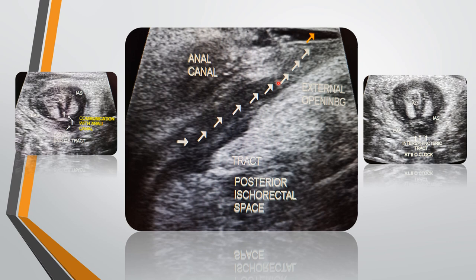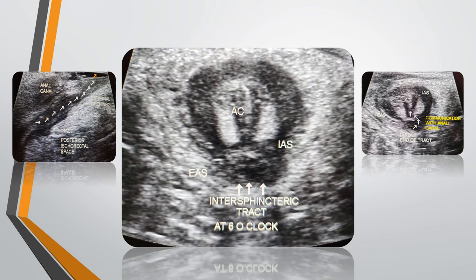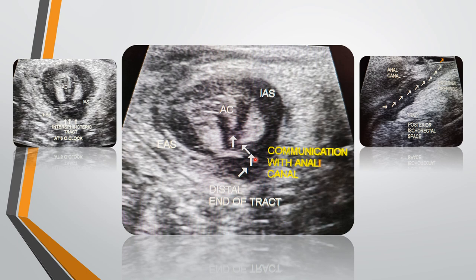First, the anal canal is screened in sagittal and parasagittal sections, then axial sections are taken. The transvaginal probe was kept on the perineum just above the anal opening at about 10 to 12 o'clock position. We can see the anal canal, the internal sphincter, and the external sphincter. The same tract is located at 6 o'clock position, between the internal and external sphincter — it has not crossed the external sphincter. This is therefore an intersphincteric type of perineal fistula with no abscess around the tract. The tract is seen communicating with the anal canal at about 5 o'clock position.